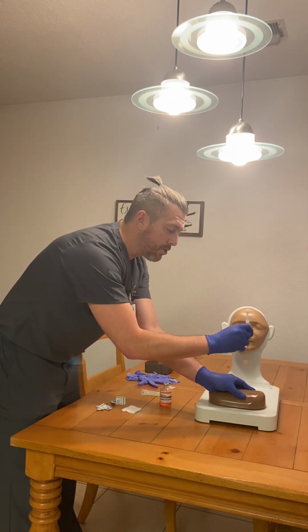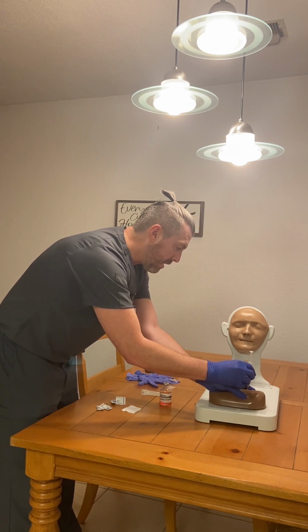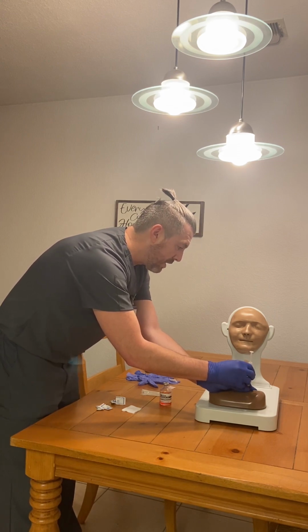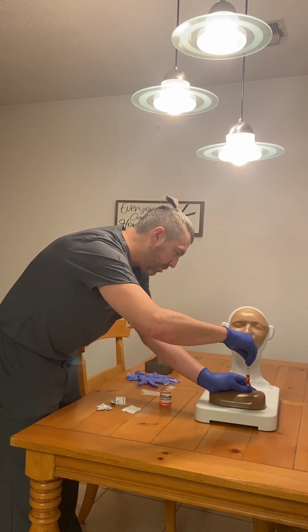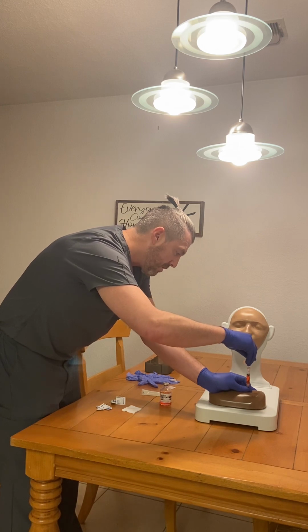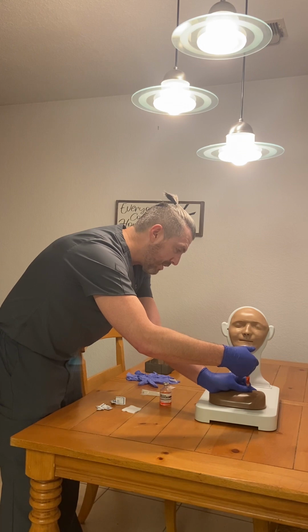Come down at a 90-degree angle, straight into it. There we are. While still keeping the pressure there, I'm holding the tip of the syringe. I'm going to aspirate to look for blood. There is no blood, so we're going to slowly inject for 10 seconds per milliliter.